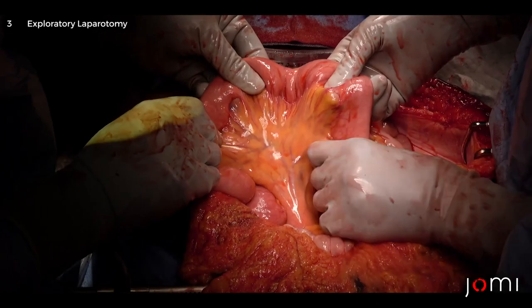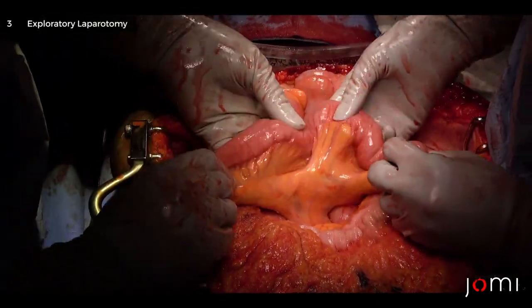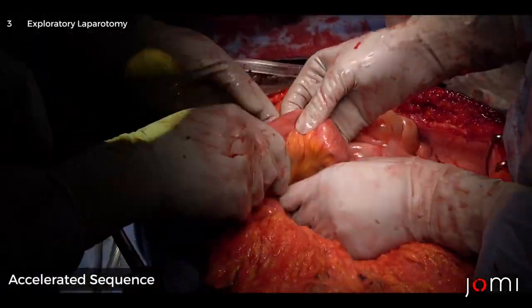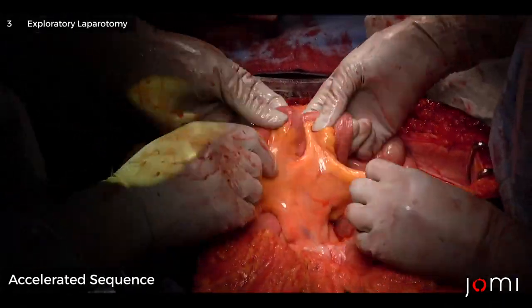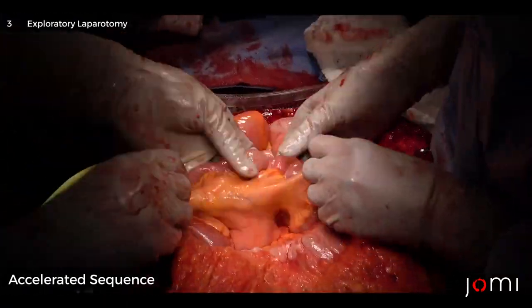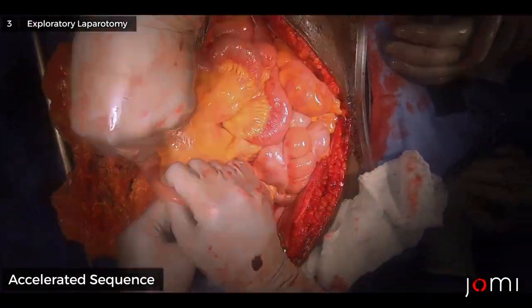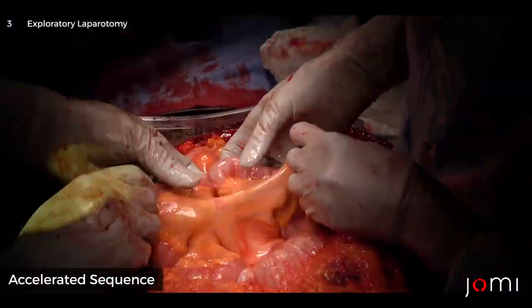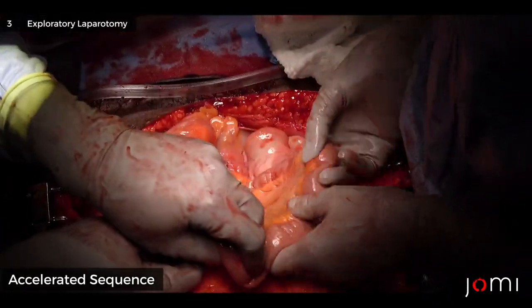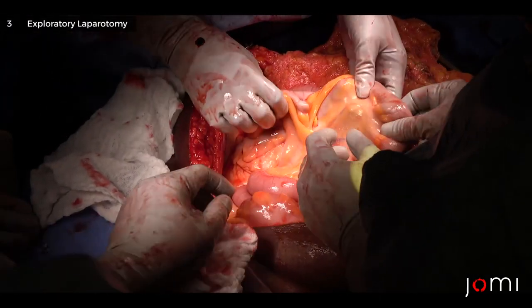Good job working together, keeping it fanned out the entire way, flipping both sides. It should be about a 10-centimeter segment flip: flip, move, flip, move, flip, move. Now if she were dumping her pressure or hemorrhaging we'd get that spleen out right away, but we clearly have time to do this first. You go with what's handed to you, but you would not be faulted for just making it clean and then doing this.